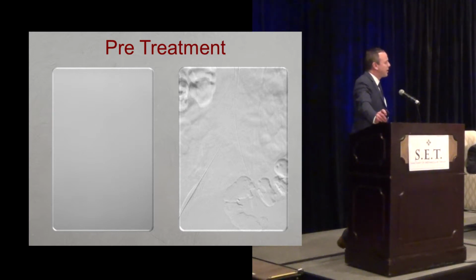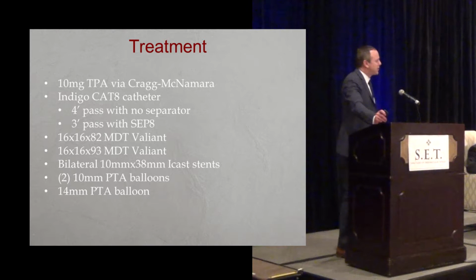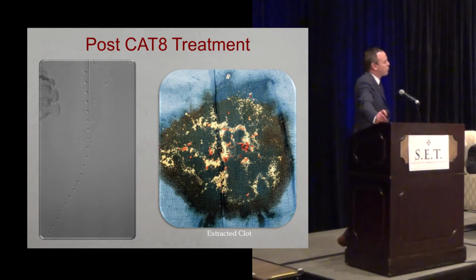We went ahead and admitted her, put her on heparin. You can there see the CT scan. There's a variety of different ways to do this. This is the arteriogram. You can see relatively abrupt cutoff, approximately 2 centimeters below the renals.